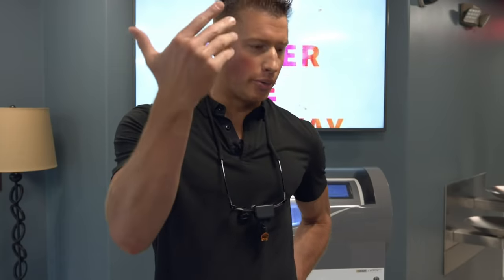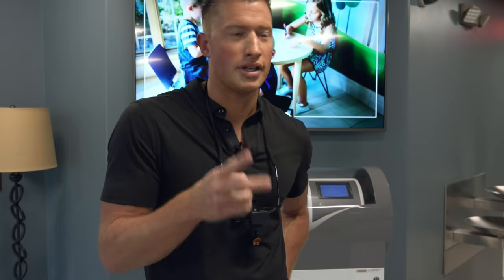So man, that's a whole other topic. What are implants used for? Obviously today we're talking about single tooth replacement, so we're replacing a single tooth with a standard sized implant. By the way, a lot of implants out there are mini implants, and I'm going to get some people not happy with me here, but that's okay. Mini implants are not intended for single tooth restorations, and the reason is there are so many disadvantages to a mini implant to replace a single tooth. It's too narrow, it doesn't have good long-term prognosis, and there's no way to adapt for angulation.